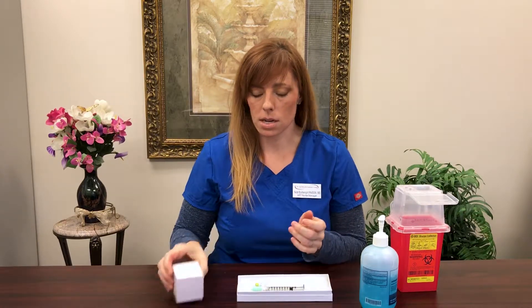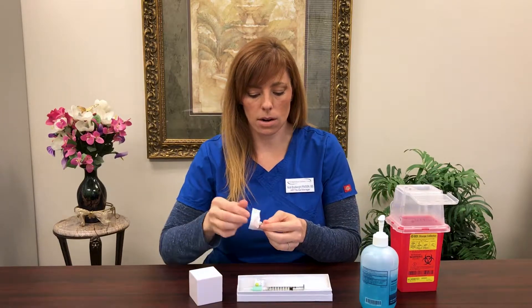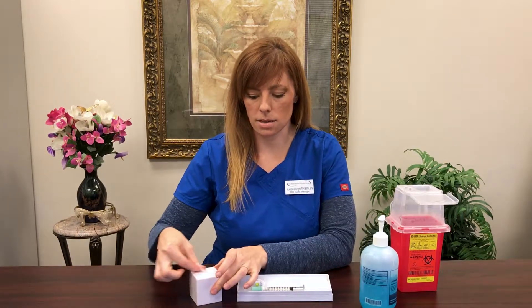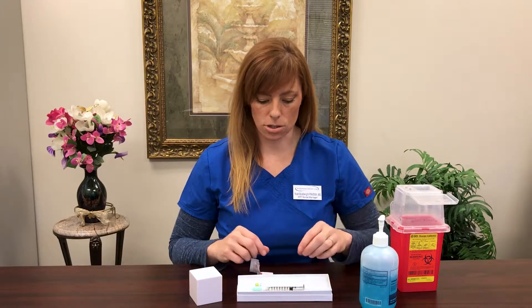Before we give our shot, we're going to wash our hands — using alcohol today, but the best thing you can use at home is actually soap and warm water. We're going to use this as our skin. Clean it with your alcohol swab for about ten seconds. Then let it air dry — no wafting, no waving, just let it air dry.